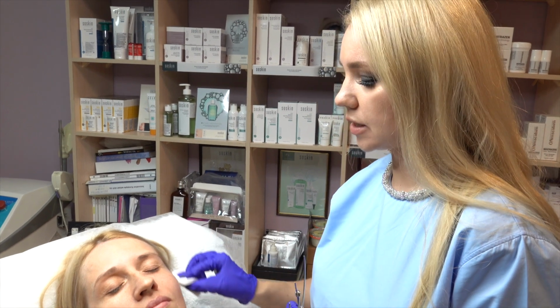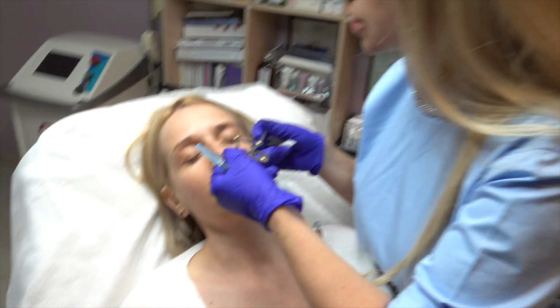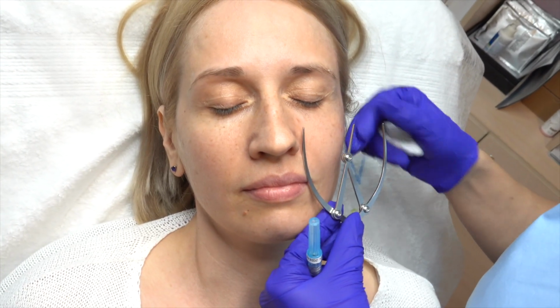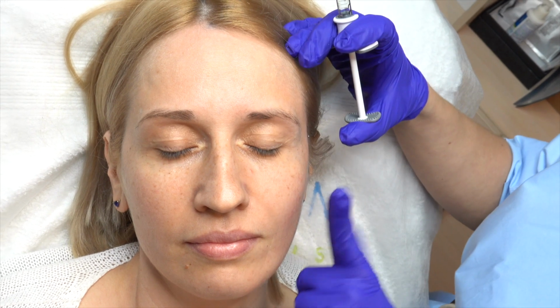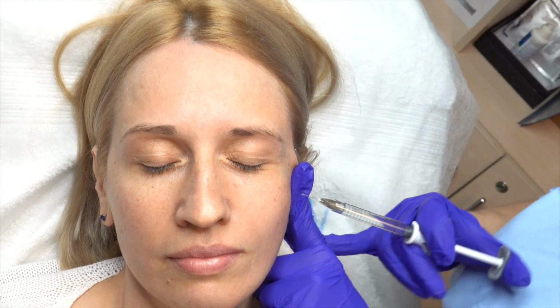And like discussed, I will start with this apex point. I just want to see again precisely where the apex should be. It should be right here, and I will start from this point. My product of choice today is Allergan's Juvederm, and this point exactly I will inject with Voluma.